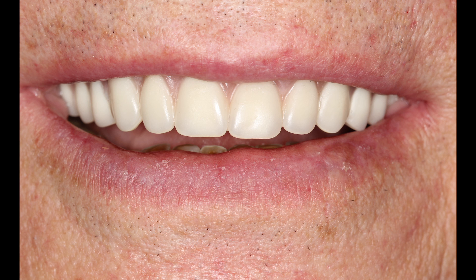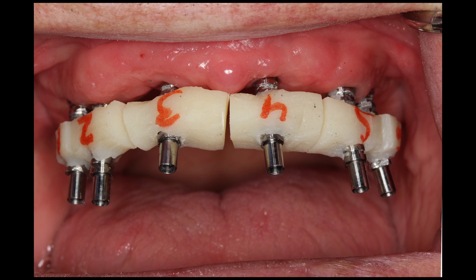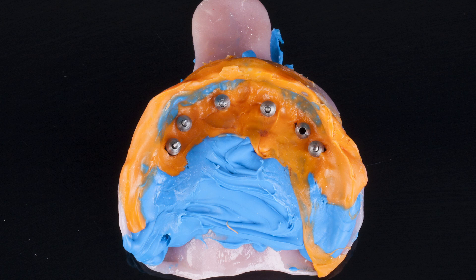After seating the wax setup in the patient's mouth and tightening the prosthetic screws through the temporary cylinders, the vertical dimension of occlusion, centric jaw relations, aesthetics, bite, phonetics, and positioning of the prosthetic teeth were evaluated. Some minor adjustments were made, and the prosthetic design was approved by the patient. After removing the wax setup, each section of the verification jig was transferred to the appropriate implant and tightened into place. After luting the individual sections together with acrylic resin, the final impression was taken with the custom tray, picking up the verification jigs. The definitive master cast would be fabricated from this extremely accurate final impression, with the implant verification jig ensuring a passive fit of the final prosthesis.